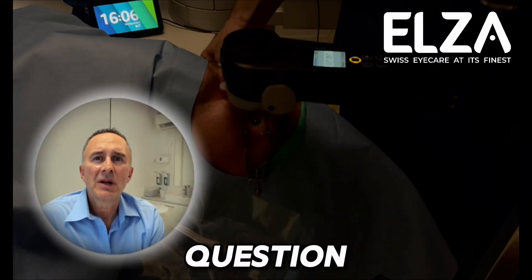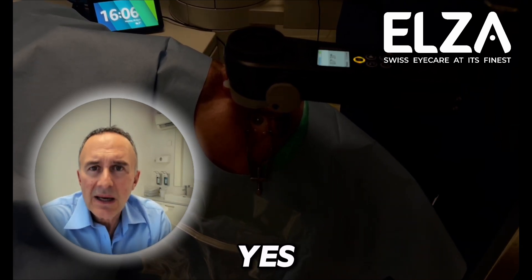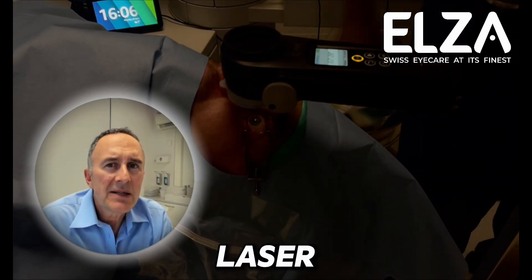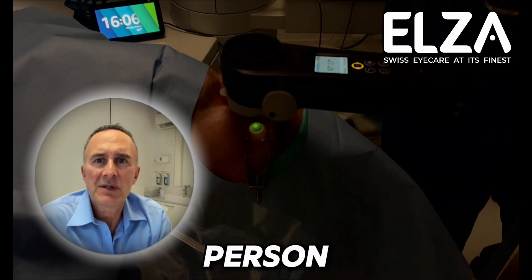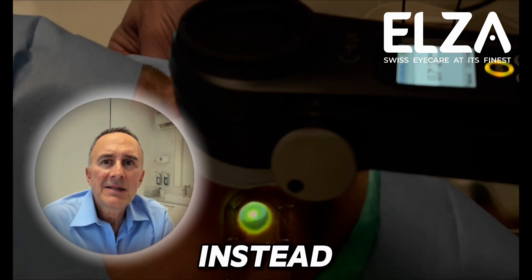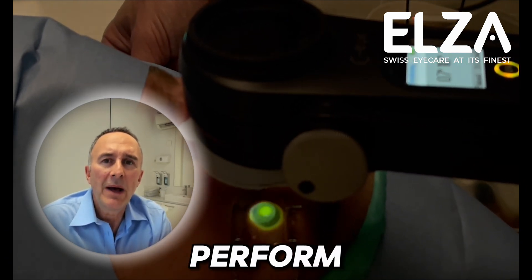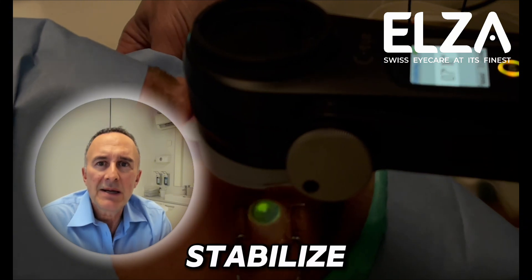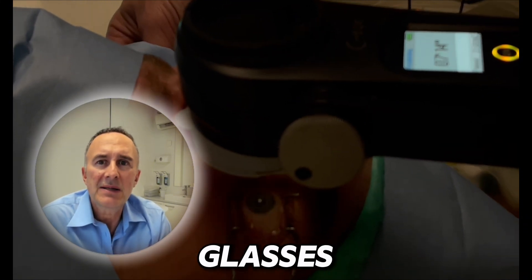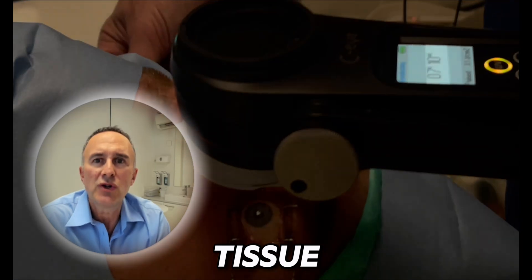Last question: did I do this in a 19-year-old? And the answer is yes. I would never perform an excimer laser in a 19-year-old because that person is simply too young and the keratoconus is still too active. But instead of stabilizing the patient with conventional cross-linking, I perform ELZA-PACE. So I stabilize and improve vision with glasses without sacrificing any corneal tissue — no tissue removal.